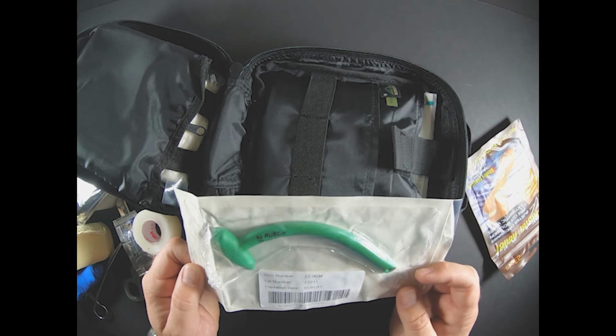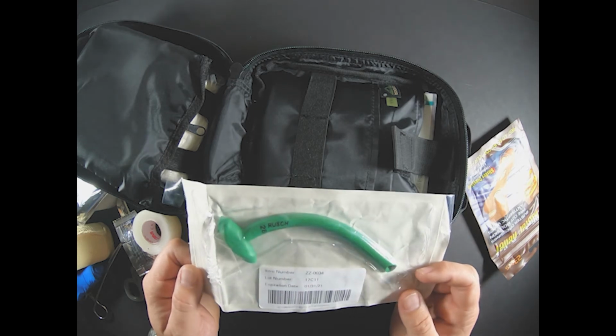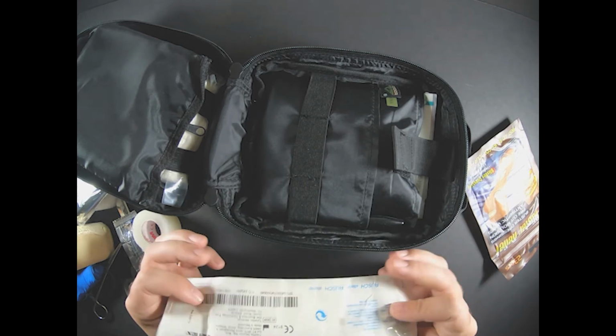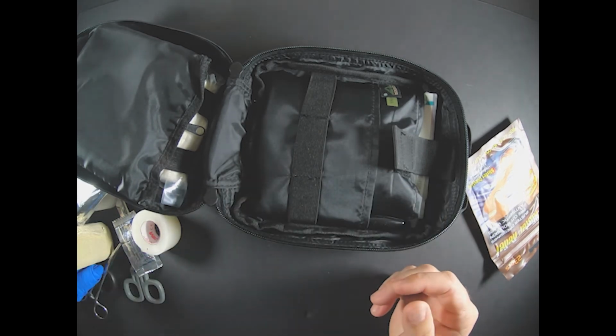I am sure it is not comfortable. This is the standard size, size 28. They do make other sizes, but the generic size.